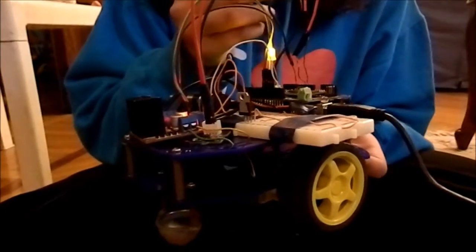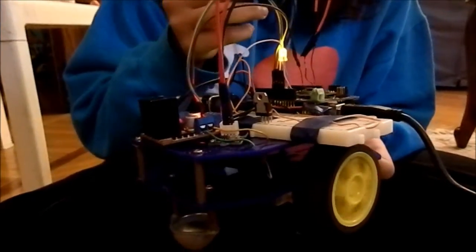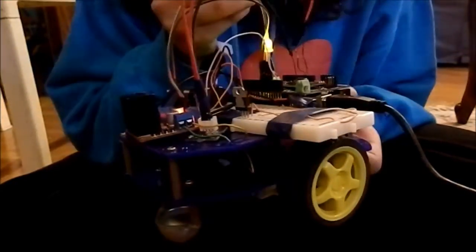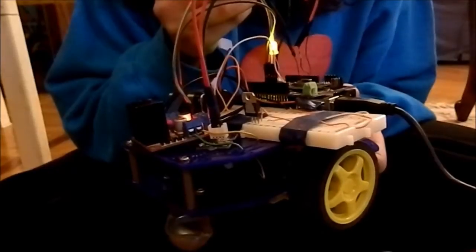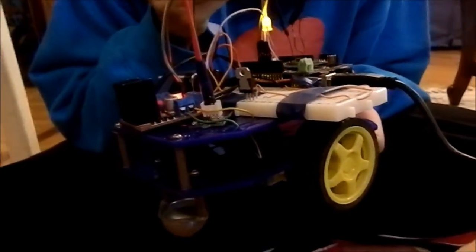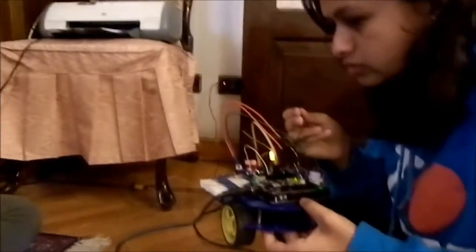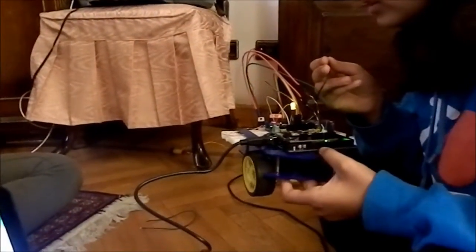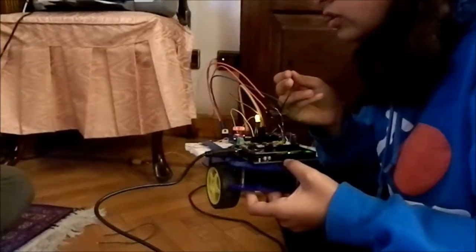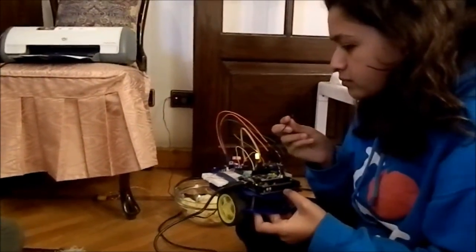A live demonstration of the voice commands follows: Arduino. Left. Stop. Right. Stop. Back. Straight. Stop. Right. Back. Straight. Stop. The wheelchair responds to each spoken command in real time.